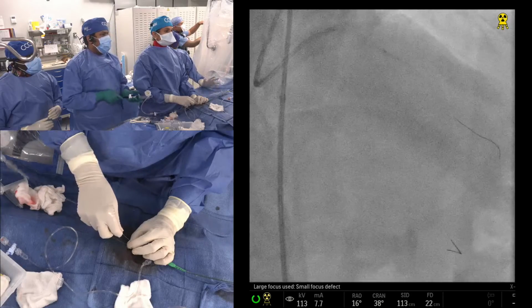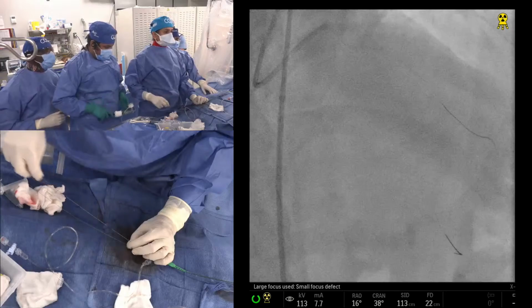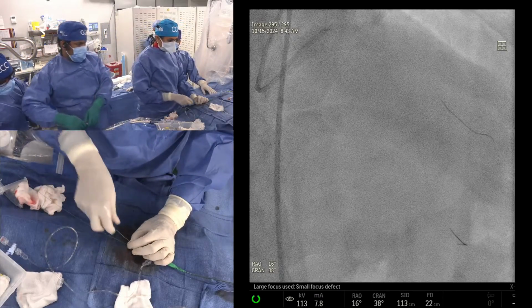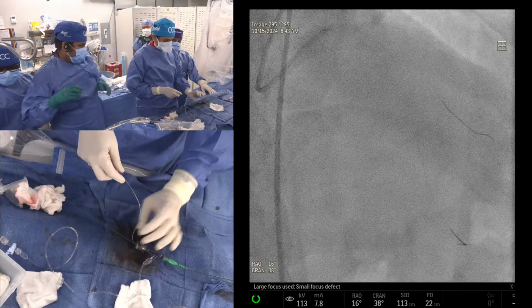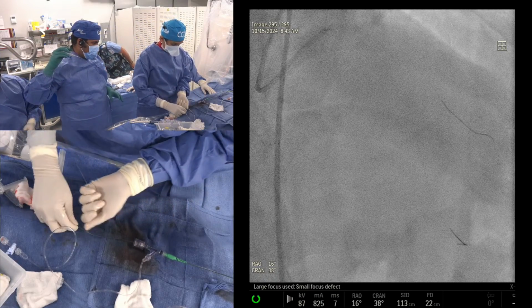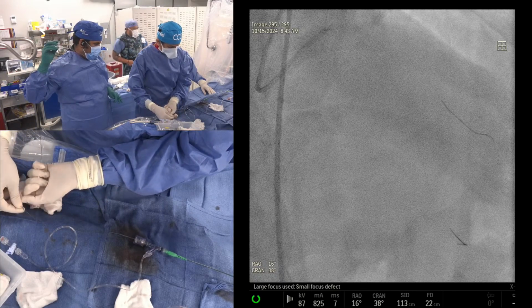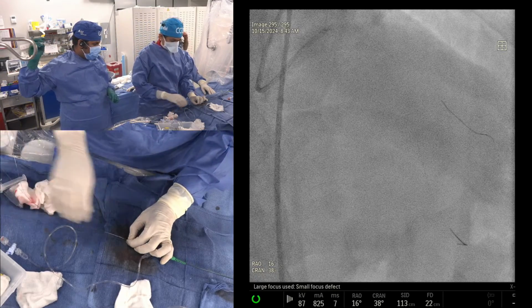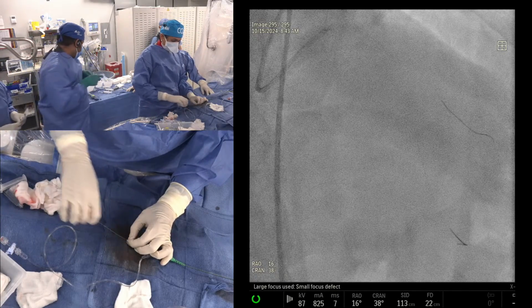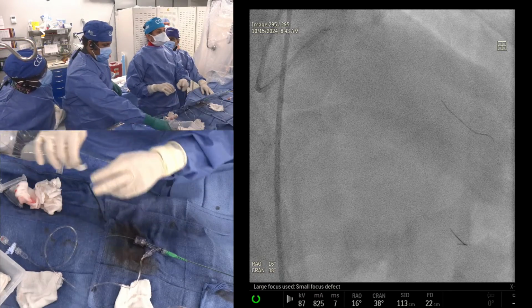Okay. If I can read this question between the lines, to help people's thinking, the intent would have been that if you fail, maybe after one or two attempts with the CTO intervention, then this patient, because of the possibility of still having a left internal mammary to the LAD, young patient, that may have been the intent of this question. And yes, I think failure of your LAD recanalization and then referral for CABG is appropriate.